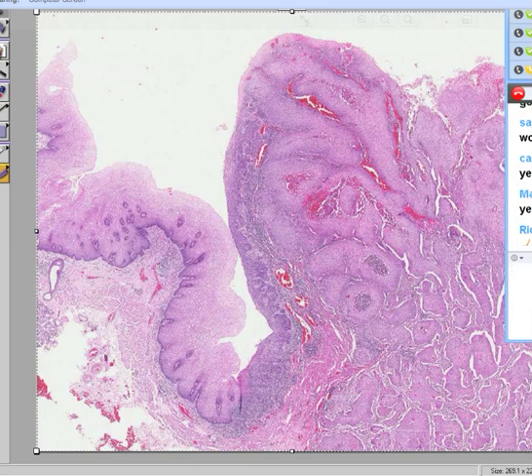Carolyn can see it. So here, let me ask you the question. Remember, go back to your basic algorithm. Don't get fancy. Don't start playing Sherlock Holmes. Go back to your basics or you will make a big mistake. The first thing you've got to do is say, what is the normal tissue? And in this case, it looks like it's some kind of GI organ again.